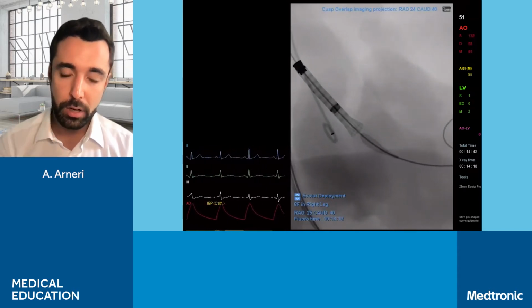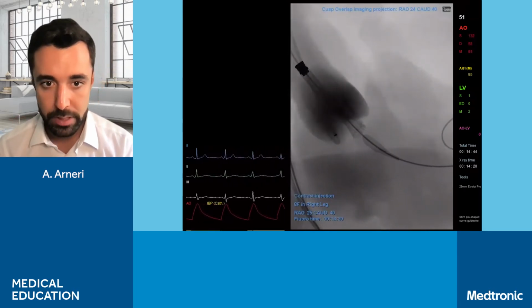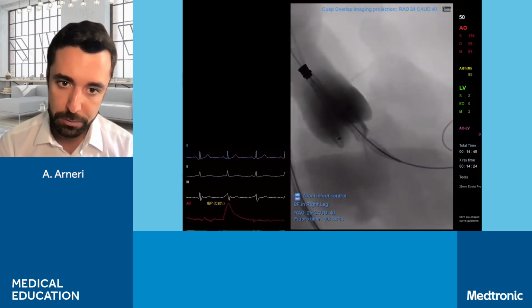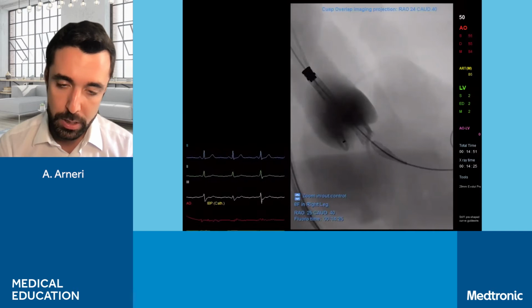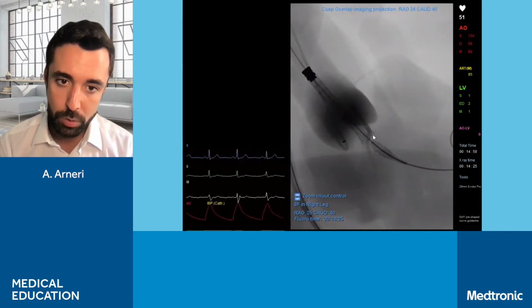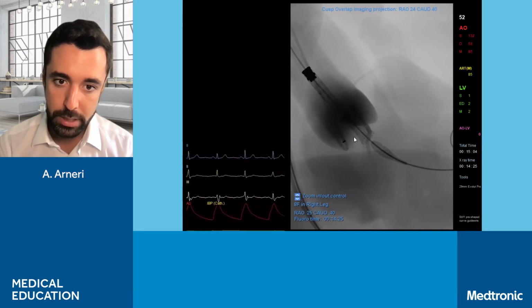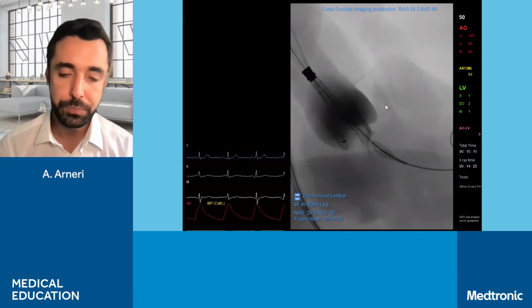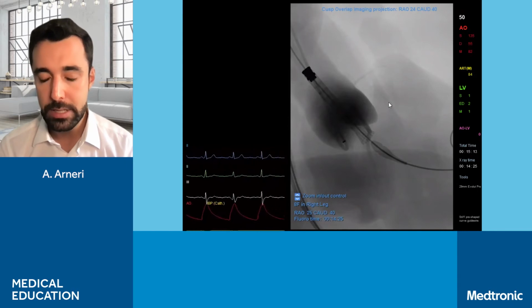We're going to do a quick contrast check to see if the valve is at the right implant depth. Maybe we can stop, George, here with some contrast. And if we start from the bottom, you see we have node 0. You can point that with the arrow. And we have node 1, which is a bit in a higher position. And you see that the bottom of our pigtail is between node 0 and node 1. So we are 3 millimeter. So we like the position, and we can go on with our release.